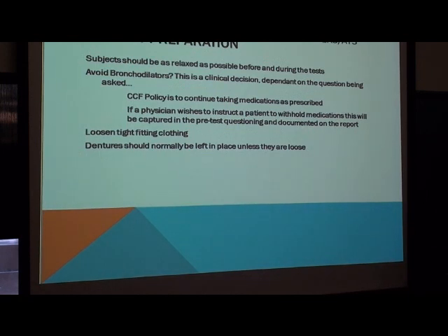And many of them actually have had bad experiences in pulmonary function laboratories where they either had syncope associated with the test that they're about to do, or they really felt poorly after the test because they came very close to syncope, or just found it very, very difficult to do in the past. And so that's one of the anxieties that you're going to try and deal with, and we'll talk about that in a little bit.